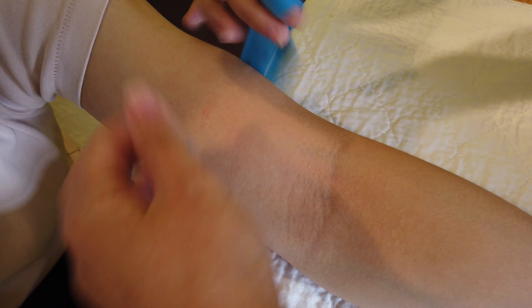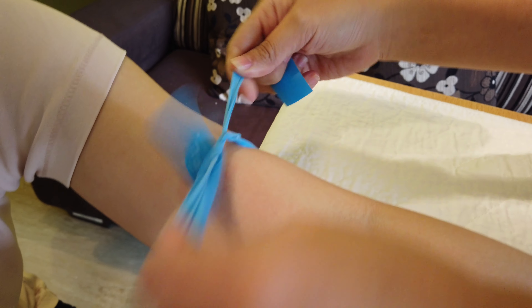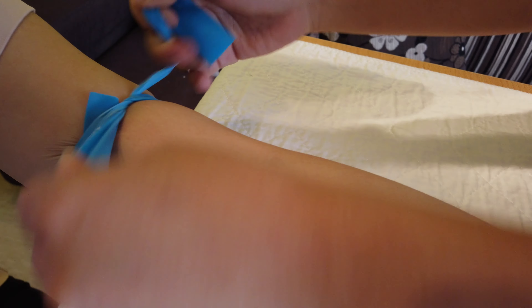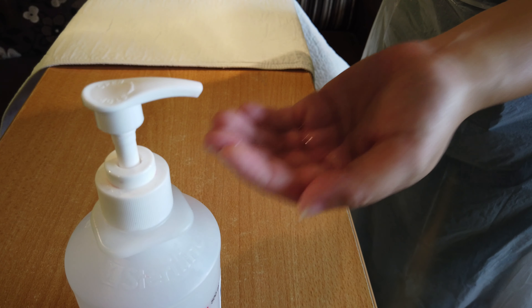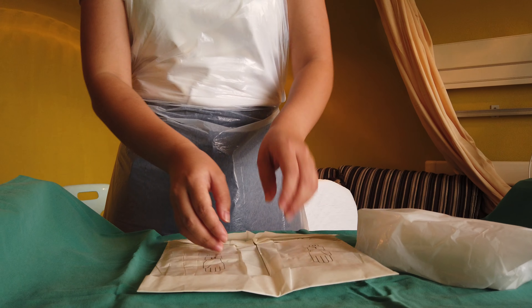Apply the tourniquet and find a suitable vein on the patient's arm. Perform hand wash once more and don your sterile gloves.